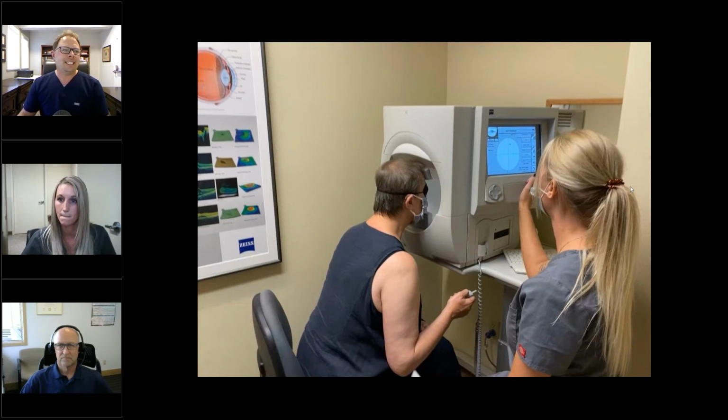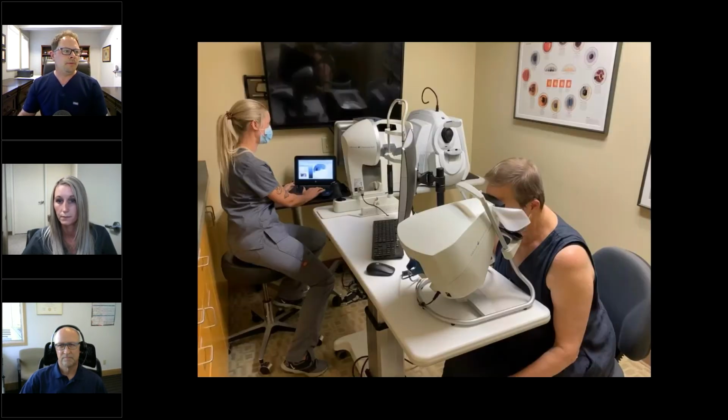space. This is kind of the corner we have the visual field machine stuck in, and this is in our special testing room. So as you can see, Brandy's here. This is just a model patient that we saw the other day. We snapped a photo because we thought it would demonstrate a principle that we wanted to talk about. So Brandy's doing the visual field. She's right there. That's about 18 inches, 24 inches at the most. With the Smartfield, she's actually quite a bit farther away.